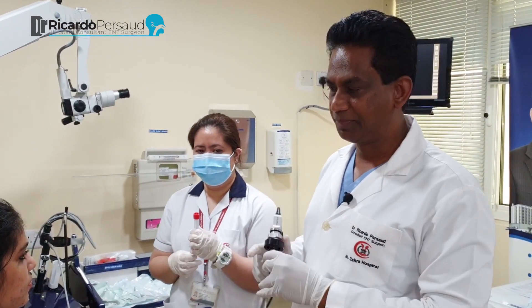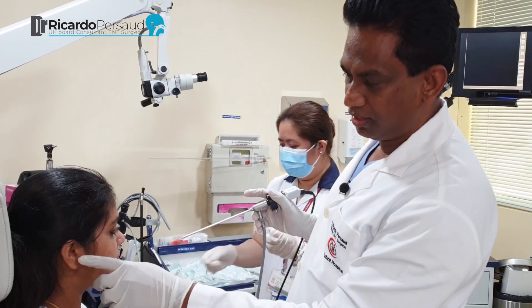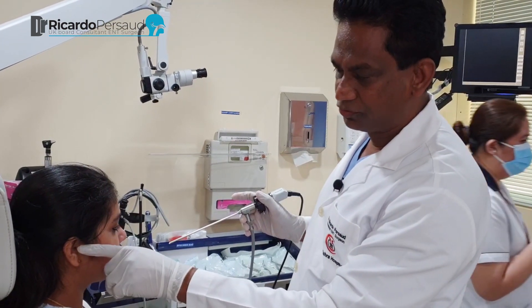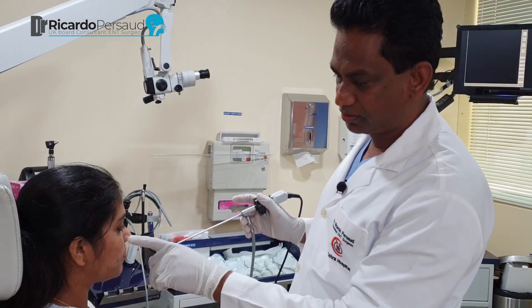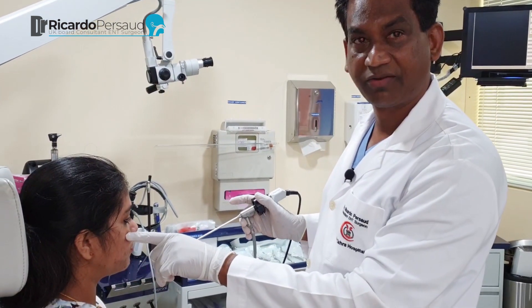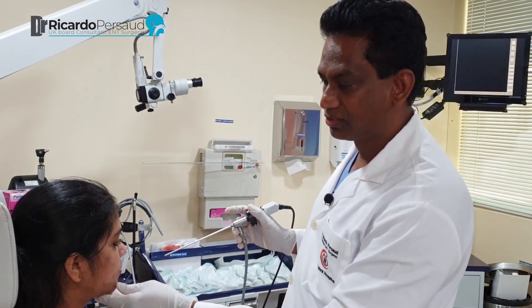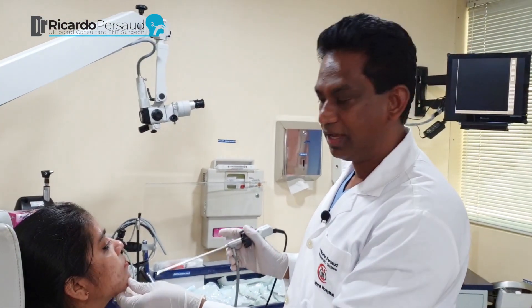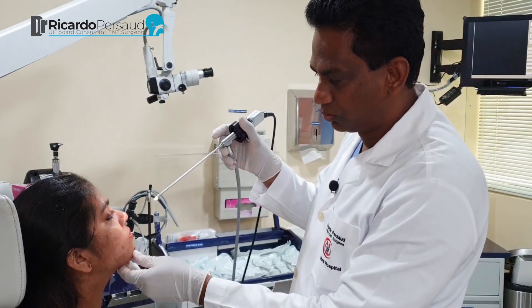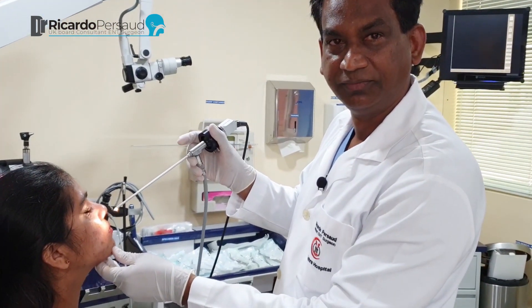Just to recap: you want to have the patient sitting upright with the line drawn from the tragus to the inferior margin of the orbit — a horizontal line. We call it a Frankfurt line. It should be parallel to the floor. So this is the wrong position. You don't want to put the swab this way. You want it to go straight along, parallel to the floor.